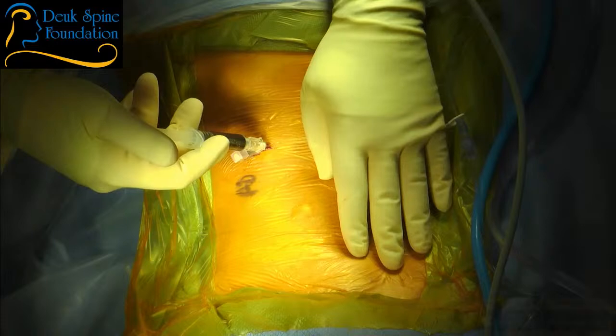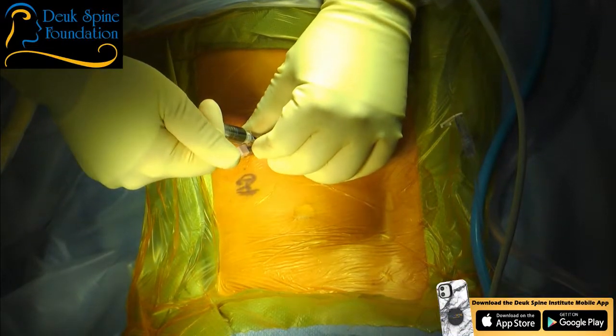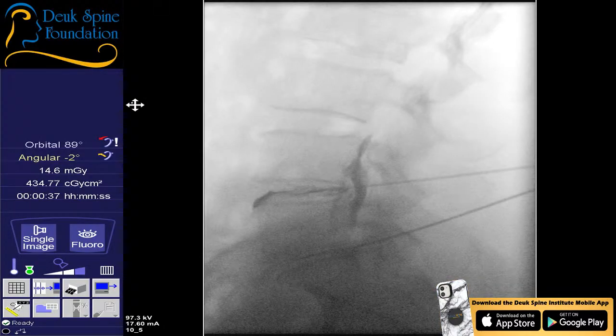Are you all right? You feeling better? All right. How bad is that on a scale of 1 to 10? What's the highest? 9? All right, that was L4-5. Is that where you typically get your pain? All right, you get to go nighty-night. I want you to count from 1 to 100.